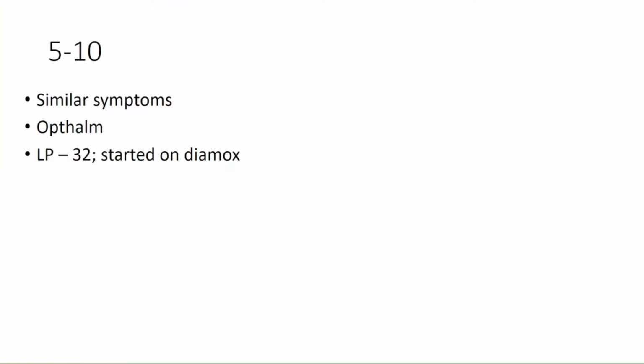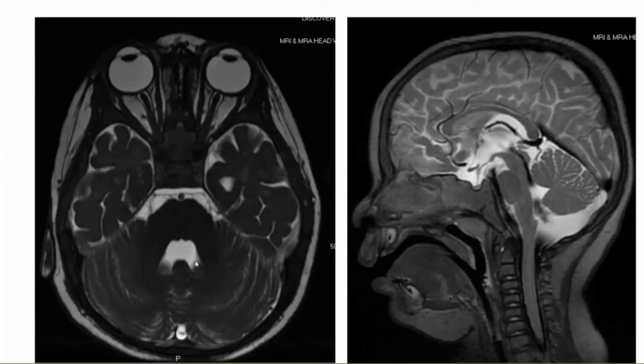At this time, the child was admitted and underwent this detailed anatomical study. These are the non-gated T2 sequences. The axial cut shows the optic disc that's prominent, that's consistent with their bedside examination. Very importantly, the sagittal reconfiguration shows that there is no obvious obstruction either at the level of the aqueduct or at the fourth ventricular outflow.